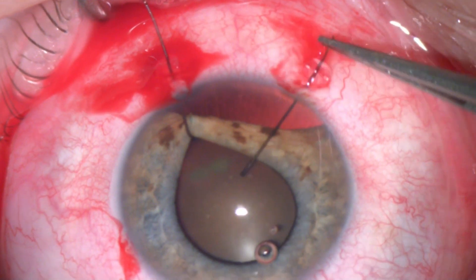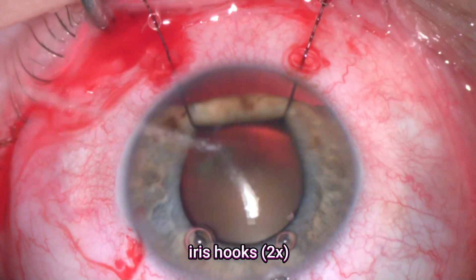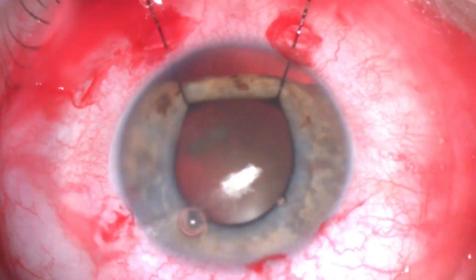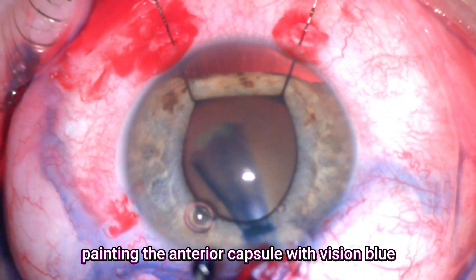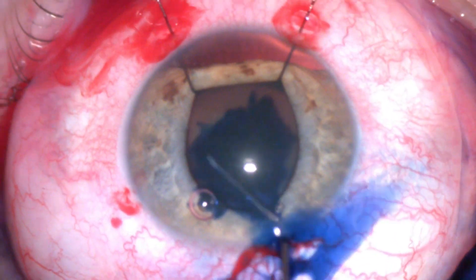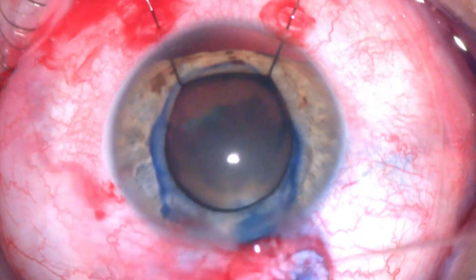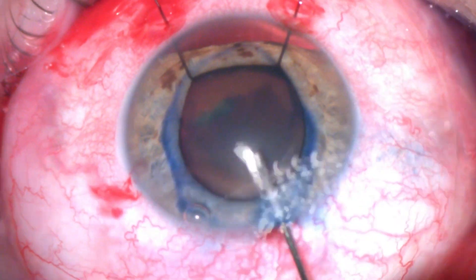I started the surgery by putting two iris hooks to gently dilate the pupil. This is followed by creating the main incision and painting the anterior capsule with blue dye. I checked this patient carefully before the surgery and I couldn't see any vitreous loss at the area of the iridodialysis.